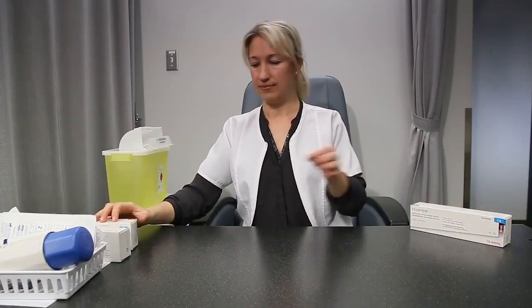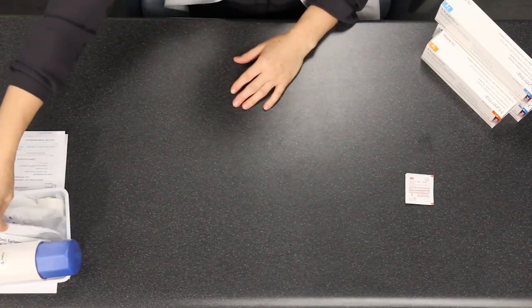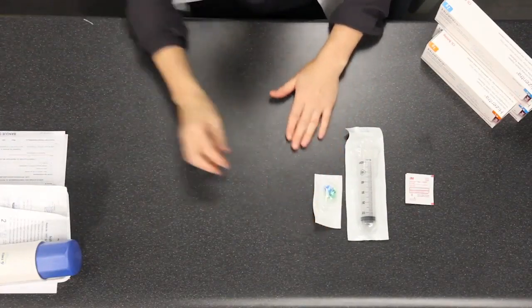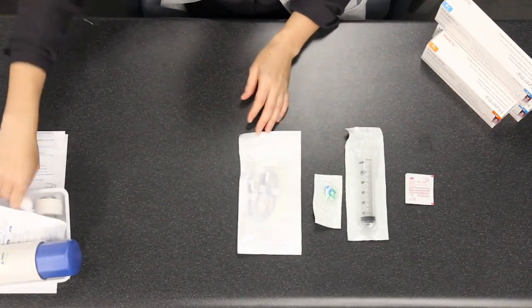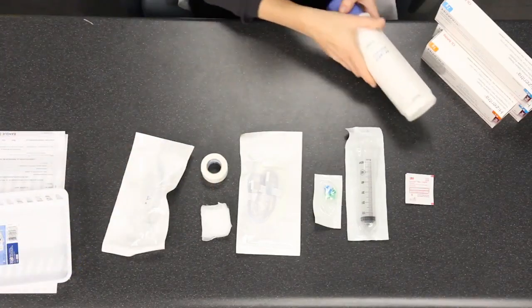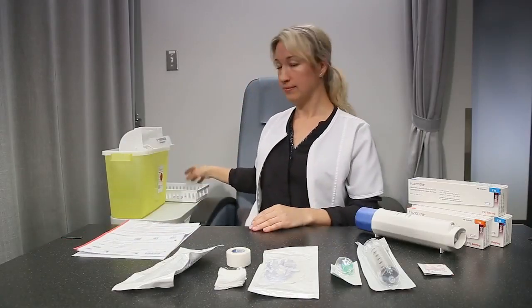You will need the number of pre-filled syringes equivalent to your prescribed dose, disinfecting swabs, a 60 cc syringe, a connection device, a tubing with needles — the number of needles will be determined with your nurse — some gauze, a transparent adhesive, a flow controller, the infusion pump, your treatment log, and a biohazard container.